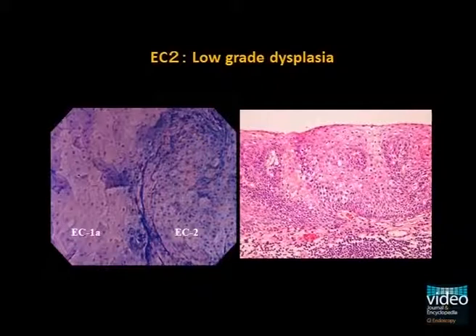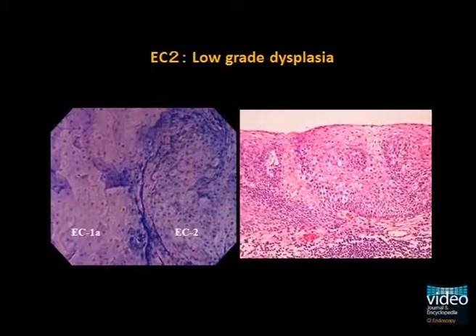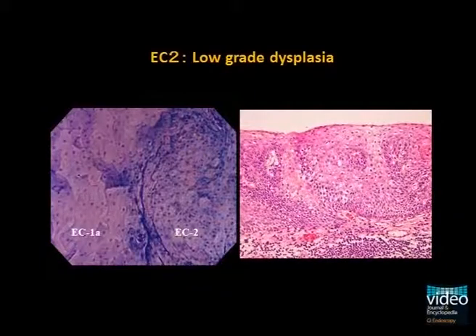The left half is normal epithelium and the right half is low-grade intra-epithelial neoplasia. This is categorized as a borderline region, EC2. Histology shows low-grade intra-epithelial neoplasia.